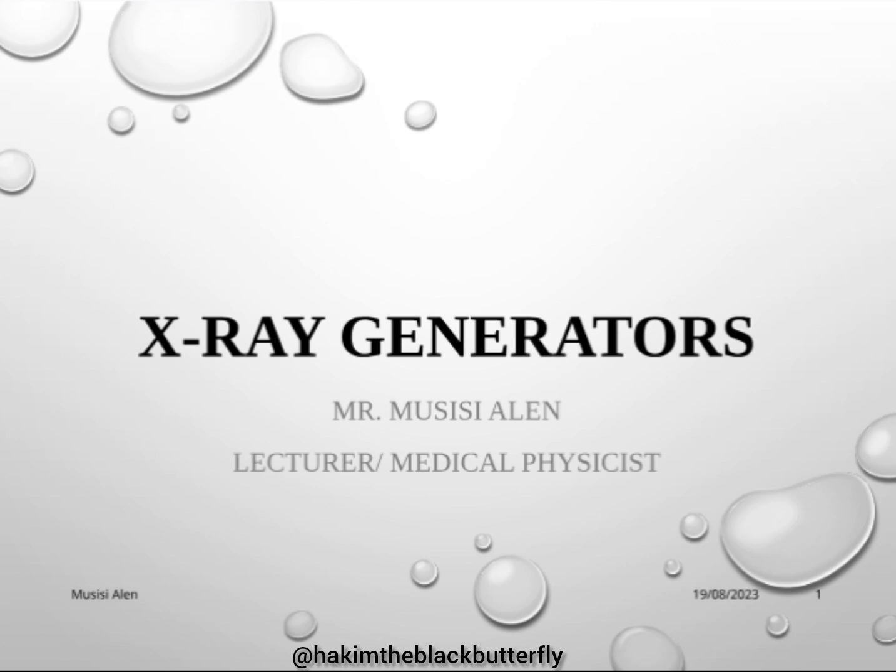The electricity does not come from the source and go straight to the X-ray tube. Electricity must go through the X-ray generator such that that electricity is modified a bit for efficient production of X-rays in the X-ray tube. And we have different types of X-ray generators, as we are going to see. But we have one which is used more in the modern machines.